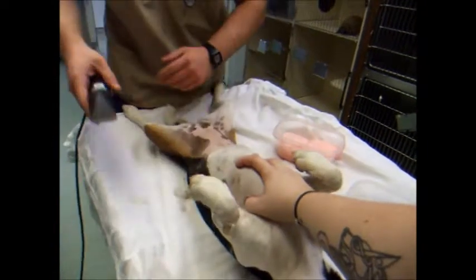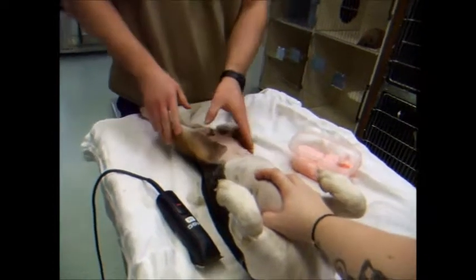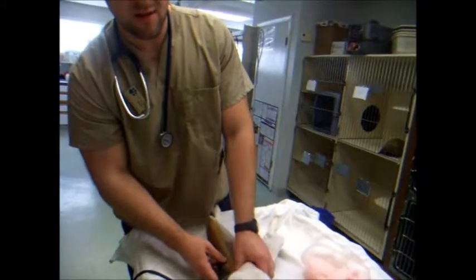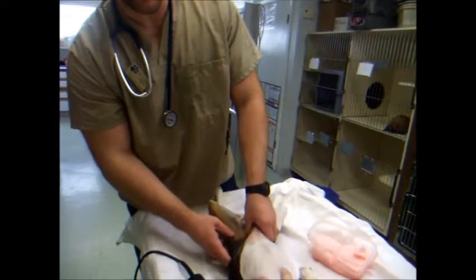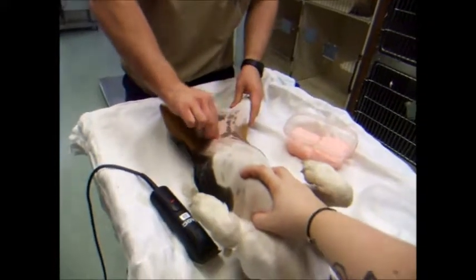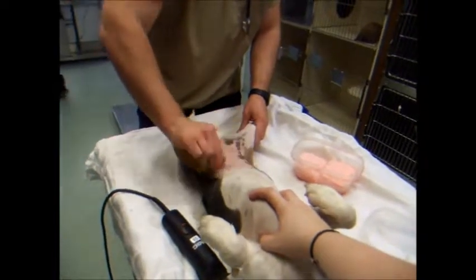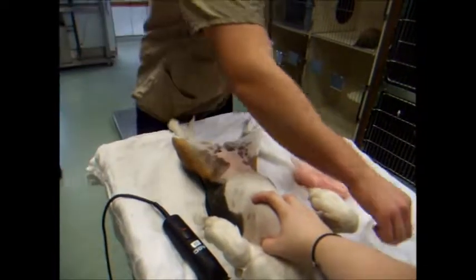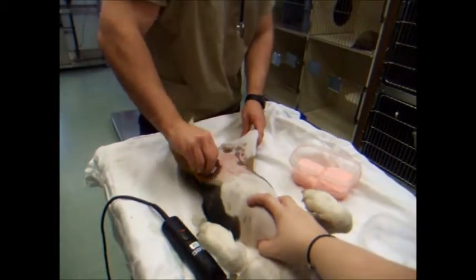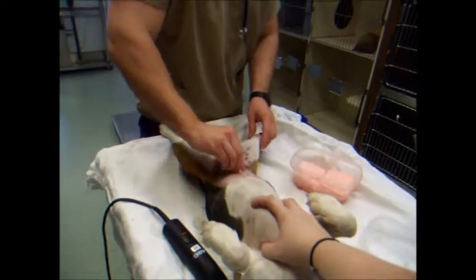So that's good on the shaving. So I'm going to palpate the bladder first, feel if she needs to be expressed or not. And it does not need to be expressed, very, very small. So now we're going to go ahead and prep. Go all the way around in a circular motion. And make sure to do this 3 times.